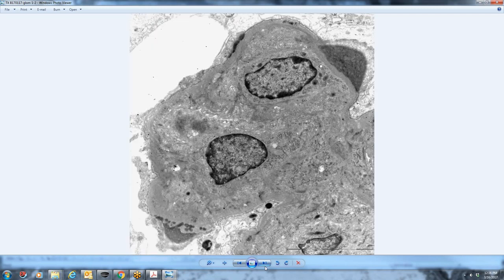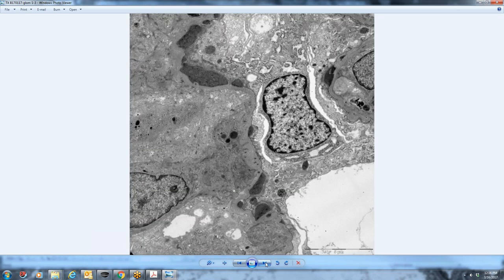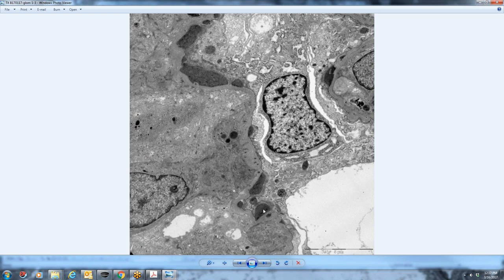Here's a higher magnification. They're just kind of sitting, flopped on the top of the GBM. Oftentimes in humans, when you see these humps, it's indicative of more complement aggregate, complement proteins as opposed to aggregates of immune complex deposits.